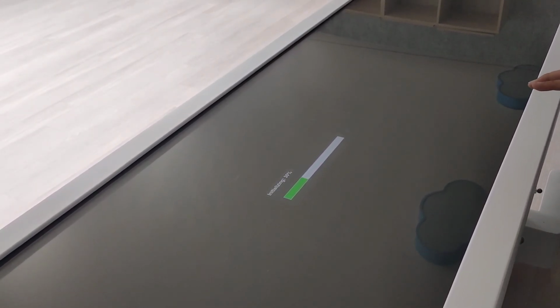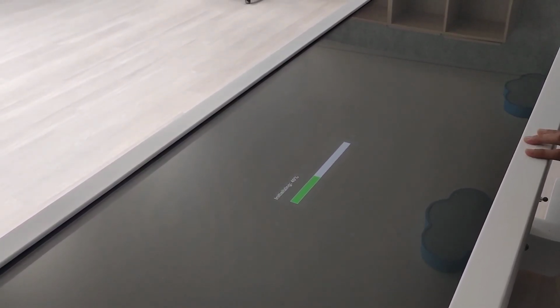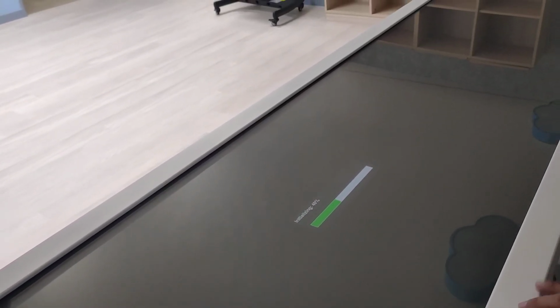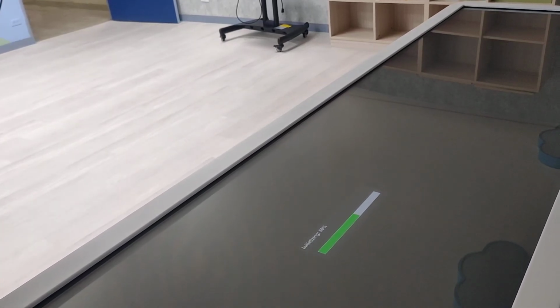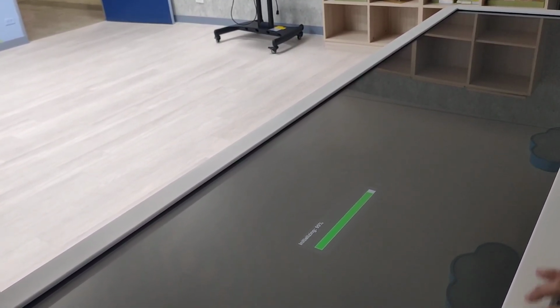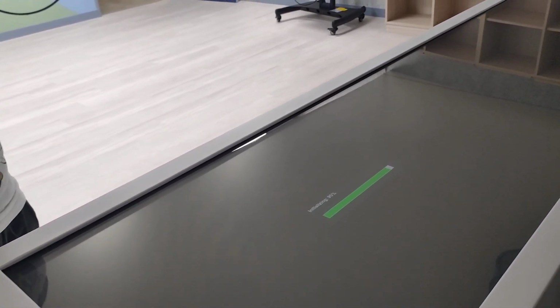Also, if you want to project the image out, you can project this image to these two computers. And also you can project this image to the fourth auditorium. There are two TVs there, so the image can be projected to the two TVs.